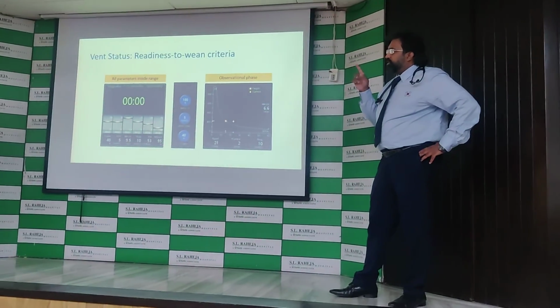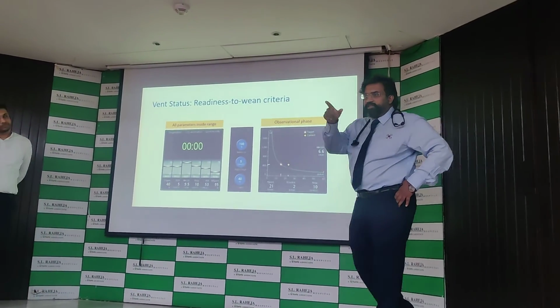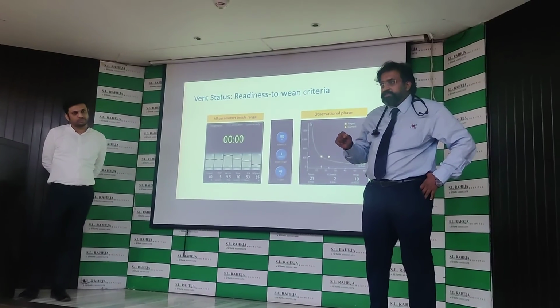Now, how do you adjust it if the patient is in distress? If you have a patient, like the other day you were telling me that the RR went up and the patient became distressed, what should you have done?